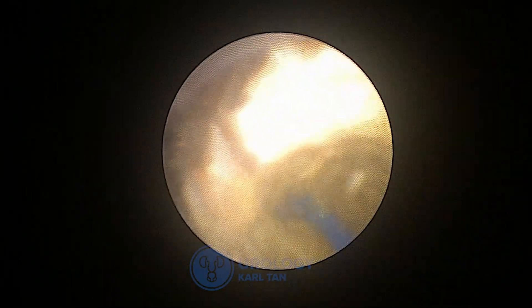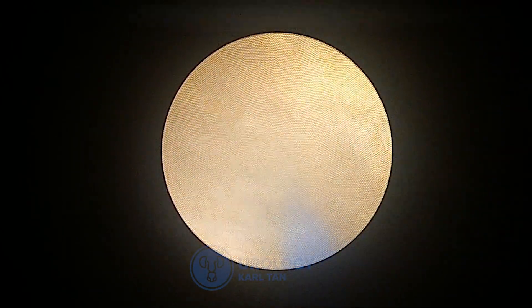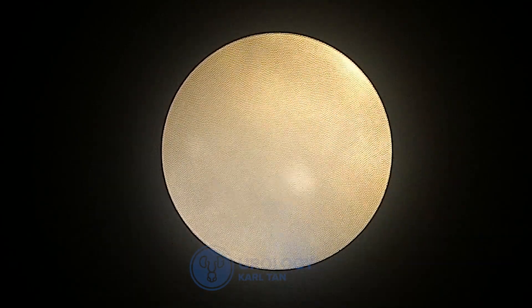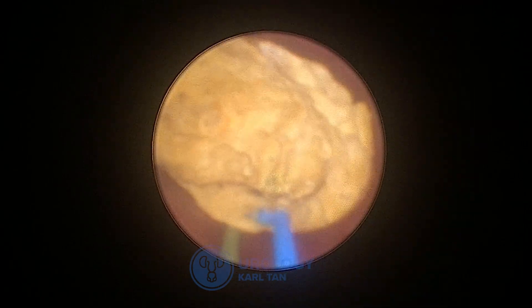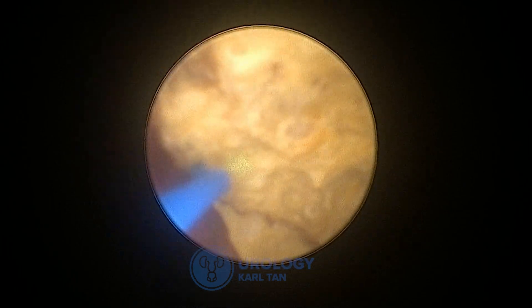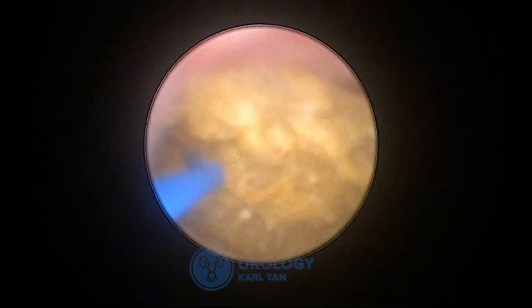You can see how nicely the dusting process happens when the Thulium Fiber Laser touches the stone. This is something most of us would love to do — it avoids a lot of stone basket extraction, and we are able to clear out the stone relatively faster since we don't have to go in and out of the ureter. As you can see, we have already cleared more than half of the stone, and we're going to start working on the sides.